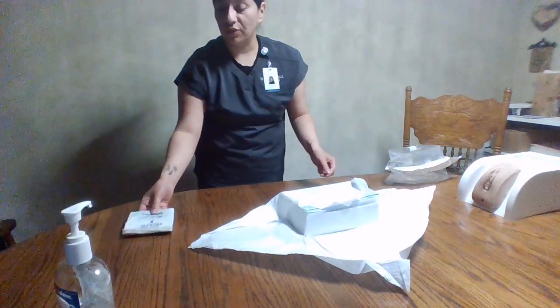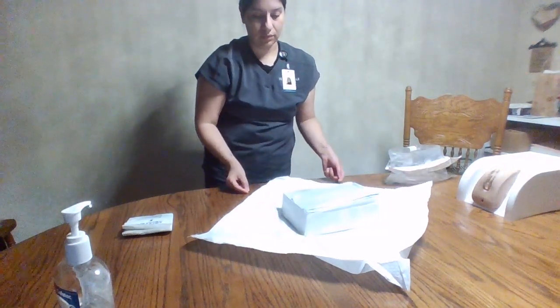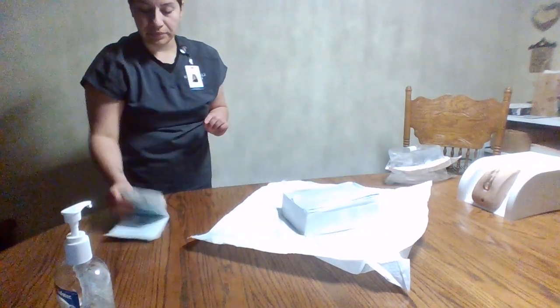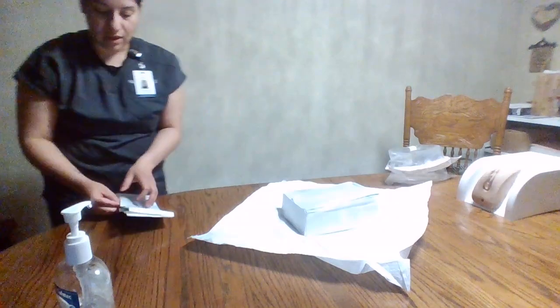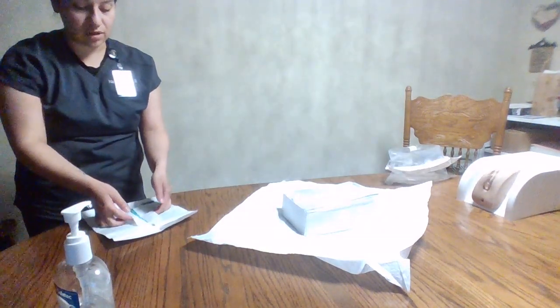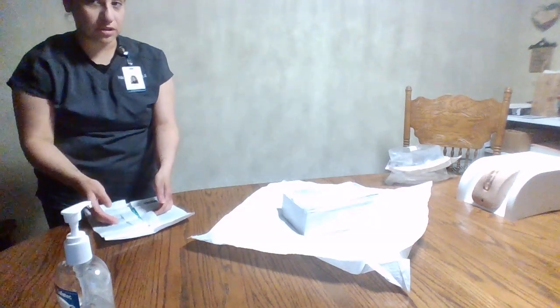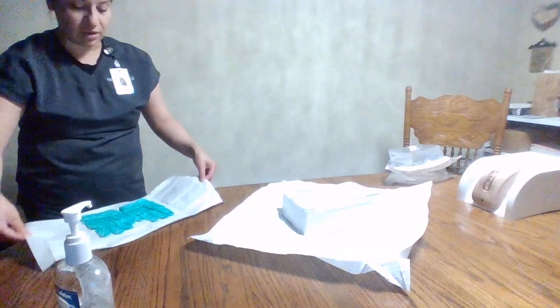And then we'll remove my gloves. And I will don my sterile gloves. Now I am right-handed, dominant right hand, so I will make sure to put on my right glove first.